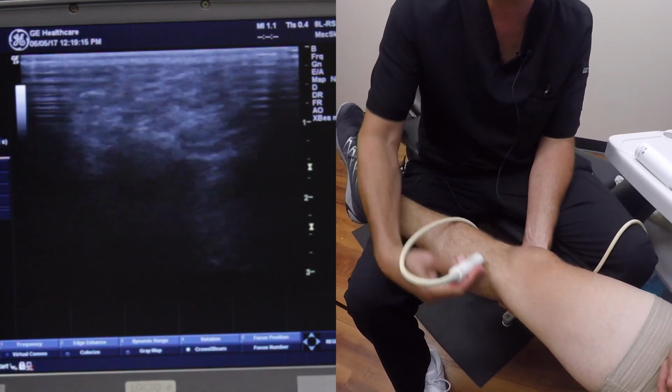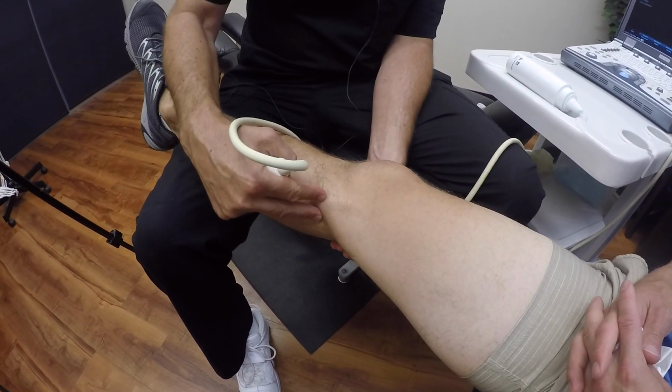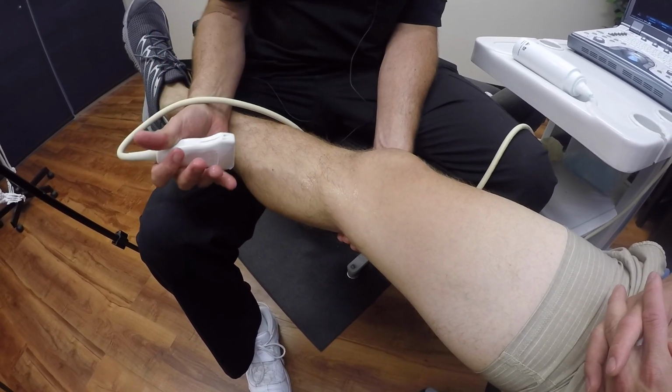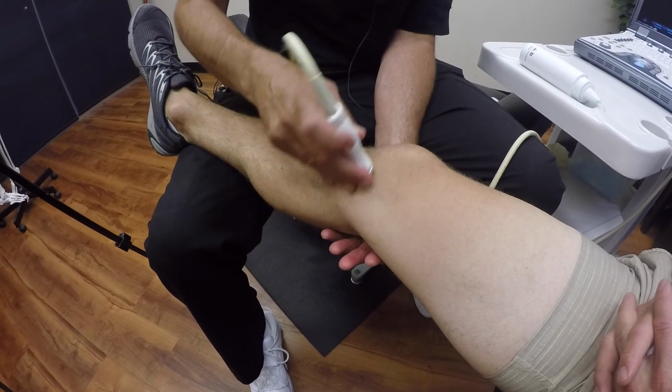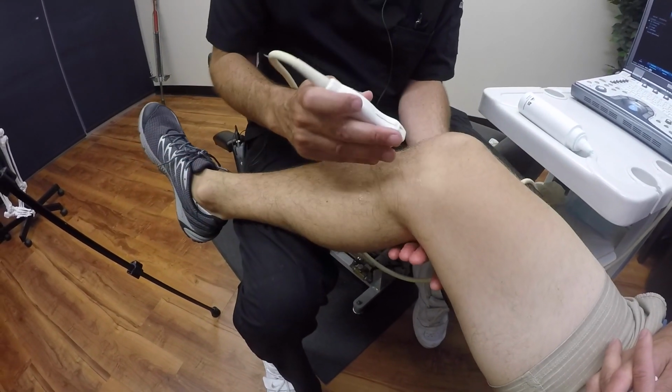So the medial joint line again consists of establishing the condition of the joint, taking a look at the soft tissue such as the medial collateral ligament and the medial meniscus, and then we can bend the knee up like this and move on to our next stop.